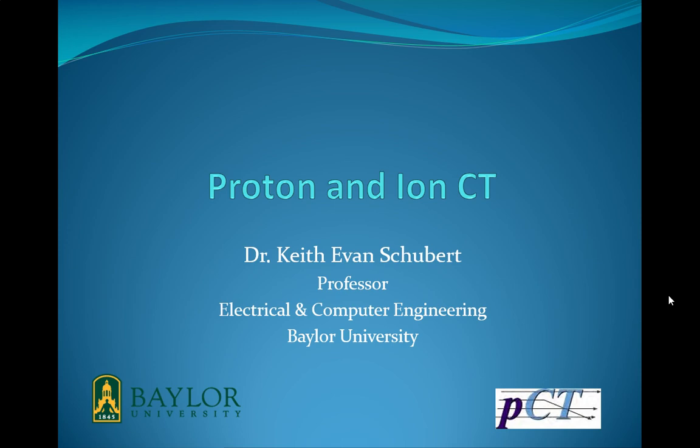For instance, I'm going to talk over the basis of proton CT, but there's actually 4 different ways I can calculate it, and there's similar variations that I can do with an X-ray CT. So we traditionally do how much energy is lost, but we could also measure how much the bending occurred. So we have an energy difference, and we have an angle difference when they're coming out. That could also be a measure of how much stuff it encountered.